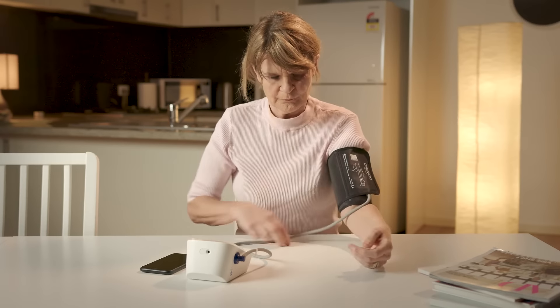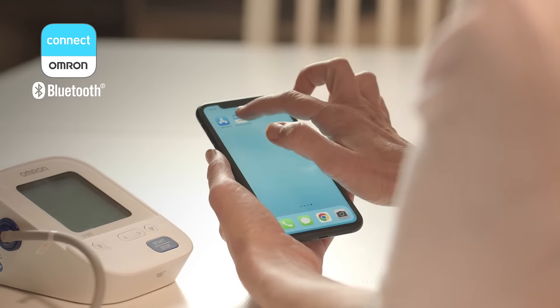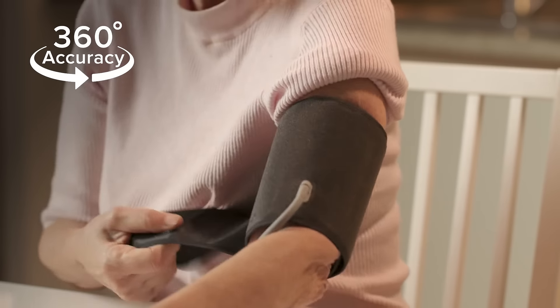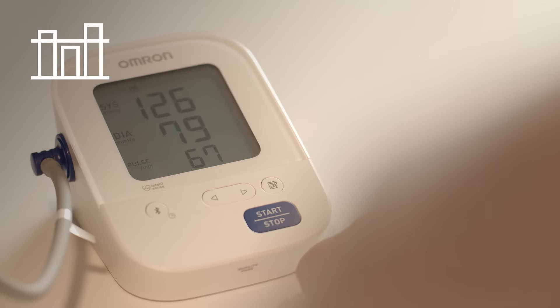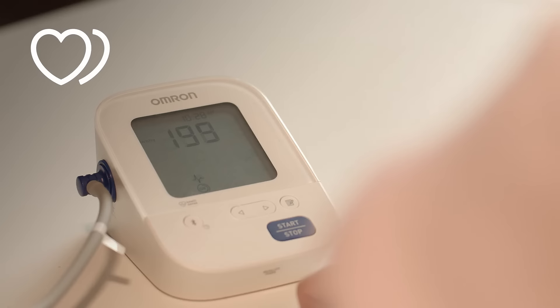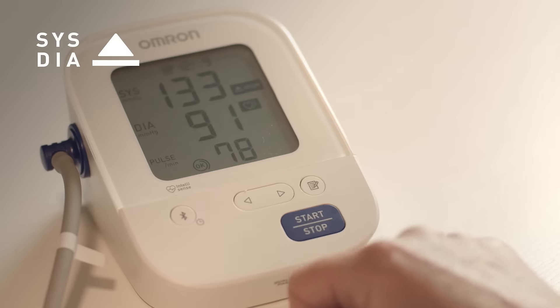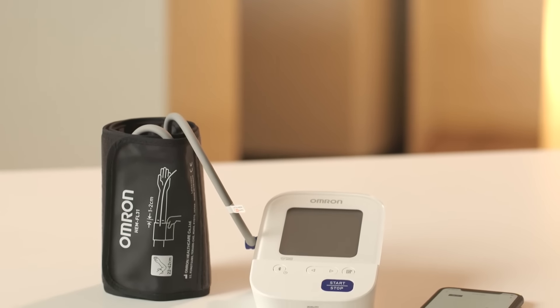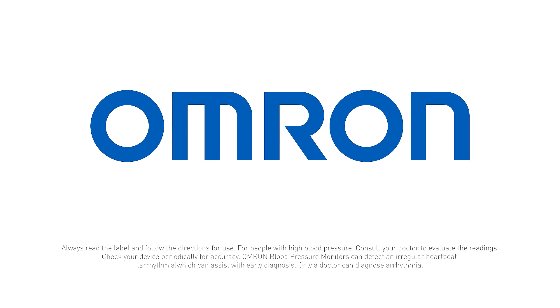This model also comes with Bluetooth connectivity. Features include Bluetooth connectivity via the Omron Connect app, 360 degree IntelliWrap medium to large cuff, IntelliSense technology, average of the last three readings, irregular heartbeat detection, 60 measurement reading memory, hypertension indicator, cuff wrapping guide, and body movement detection. Learn more about the Omron HEM7156T Plus blood pressure monitor at omronhealthcare.com.au.